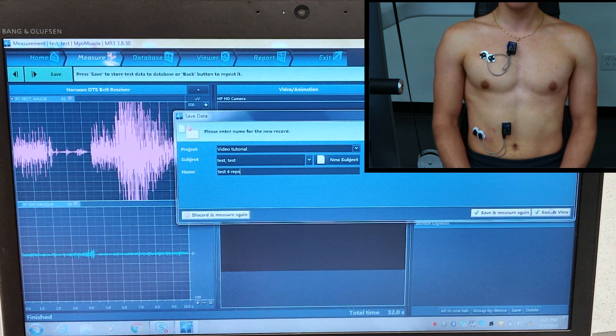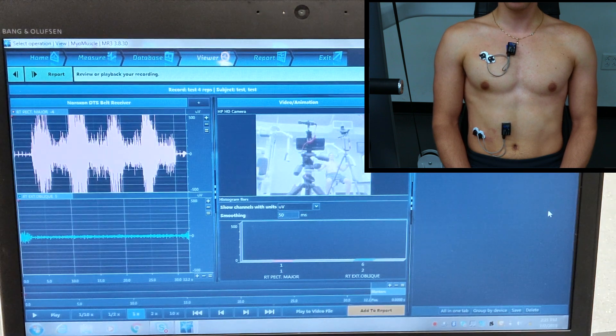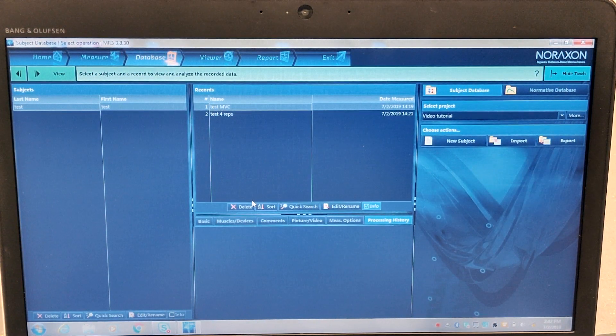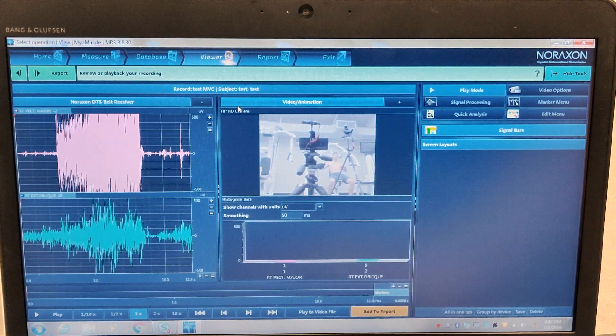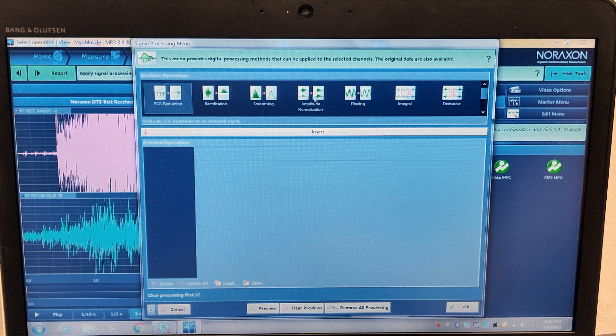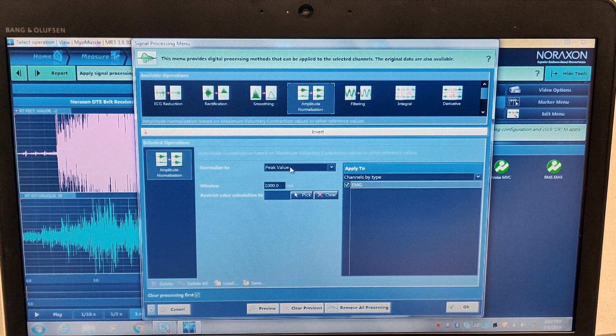We'll hit Save and View, and that brings us to the end of our data collection phase. We've finished our measurements and you're going to find yourself in Viewer. Go into Database at the top left, and from this screen we'll decide which trials were what. We know this is the MVC, but we need to tell the computer that it is the MVC. So we'll click that and hit Signal Processing over on the right, which will allow us to clean up the signal and find a peak value.